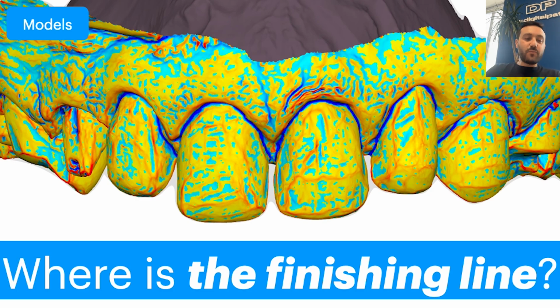This 3D file with the visible finishing line can be attached directly to the case we send to the lab. So it becomes a powerful guide for the technician, ensuring they design the CAD with maximum accuracy and zero guesswork. This is not just a scan, this is communication between dentist, patient, and lab. And communication is what makes a good restoration a perfect one.